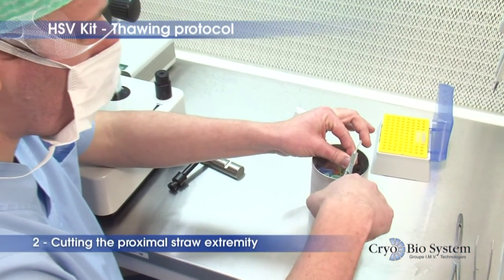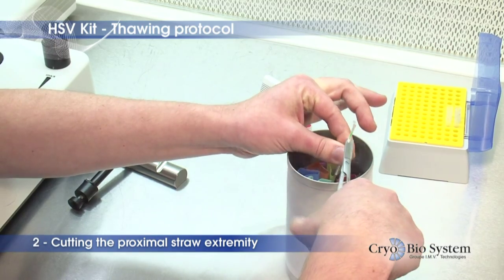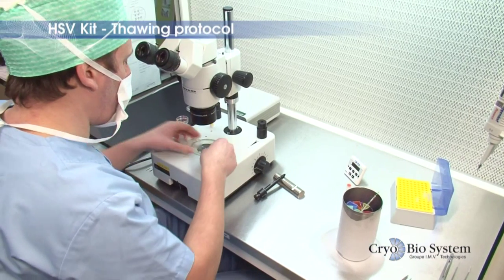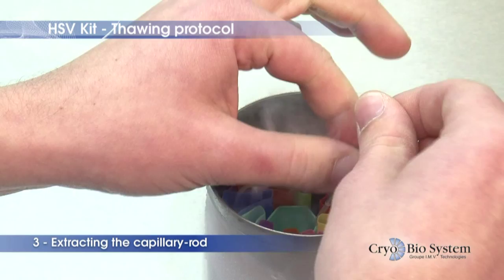Roll the straw between your fingers while applying successive pressure with the scissors until the straw is fully cut. Remove the cut part of the straw. Grab the coloured rod to remove the rod and capillary.